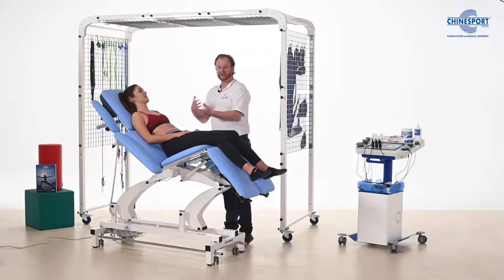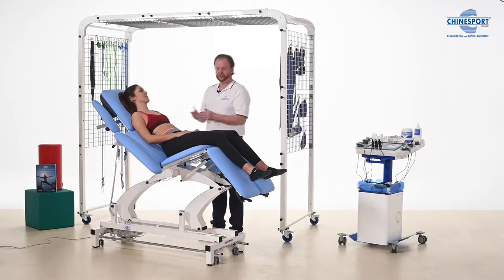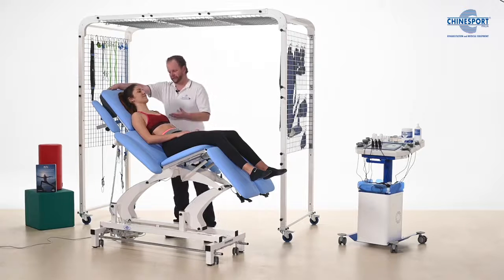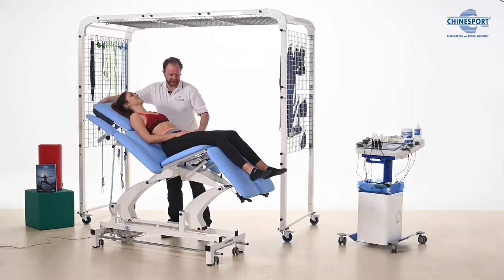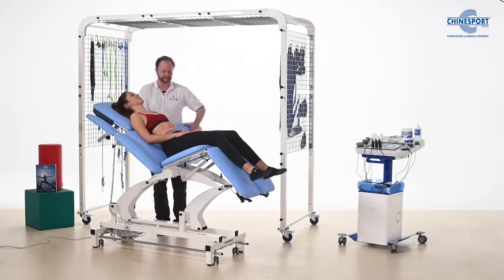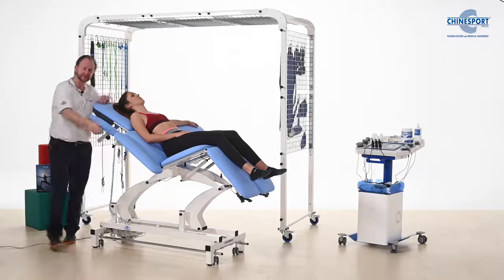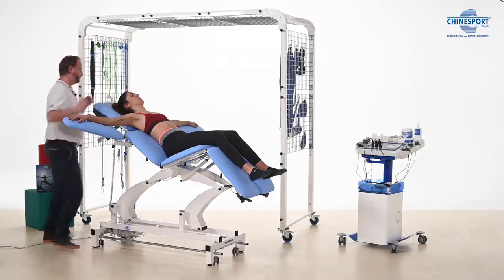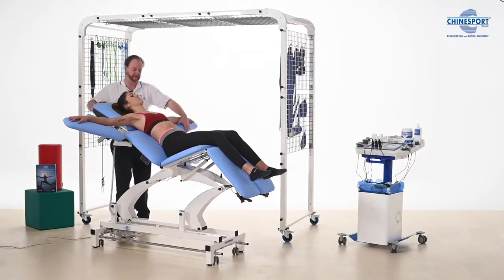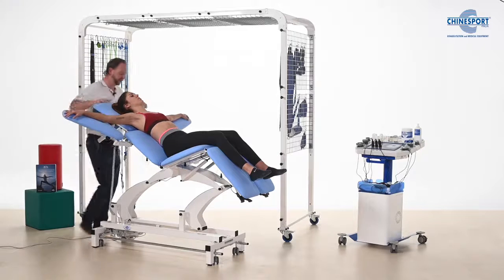And here we have eye-to-eye contact. We're at the same level, so we can use this opportunity to inform the patient and to relax the patient. We're not going to explain to you what you have right now, but at this point in time it's fine that we take this opportunity just to maybe teach some of the abdominal breathing, and like this we can start focusing on stretching the intercostal muscles and the pectoral muscles.